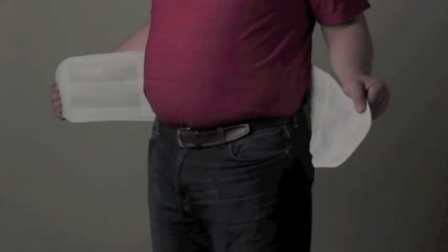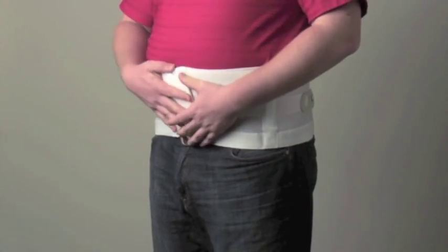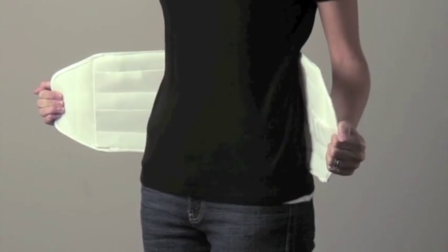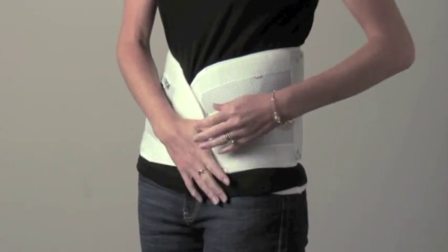The Quickdraw is designed to fit all anatomies, including pendulous abdomens and large hip-to-waist ratio patients. The Quickdraw should be angled as needed to achieve a proper snug fit.